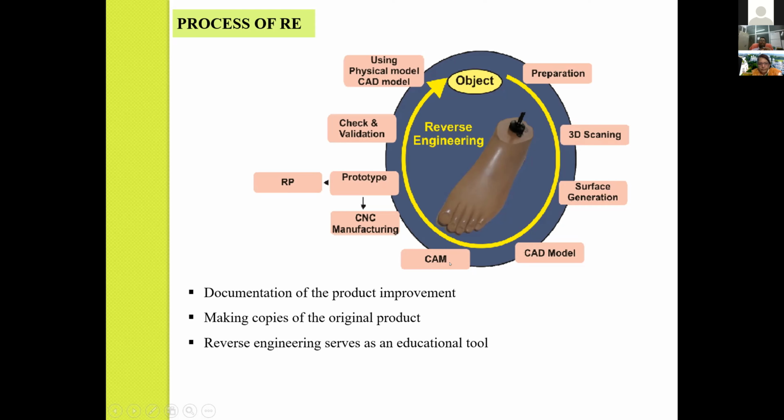So it can be through any kind of conventional, casting-based process, or any advanced digital manufacturing, in terms of CNC machines. Okay, or any 3D printing is also some digital manufacturing. So we create a prototype, then we do some checking of the model, and we validate it for our own purposes. So finally you directly have a physical model.